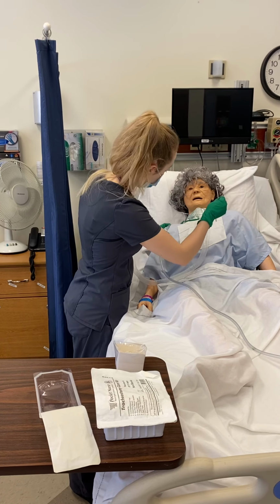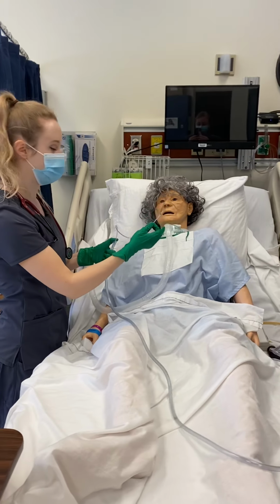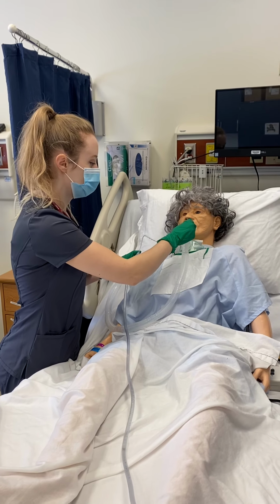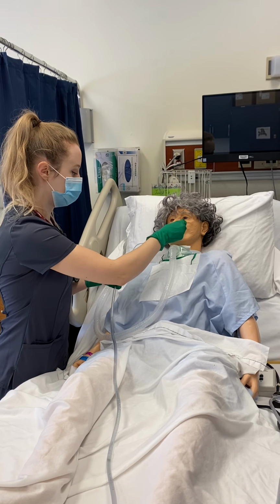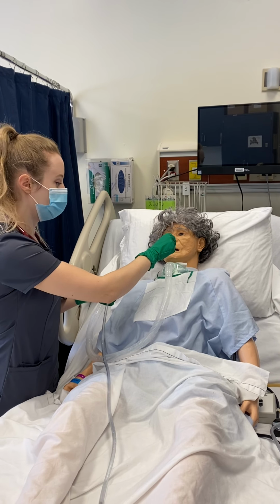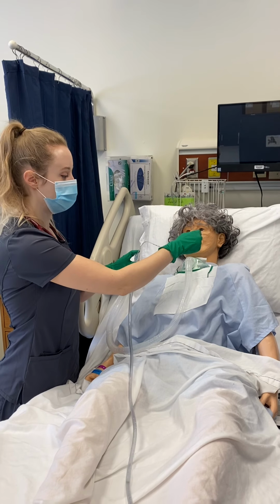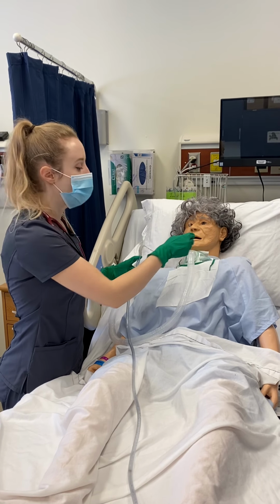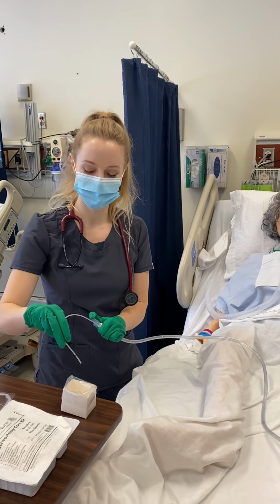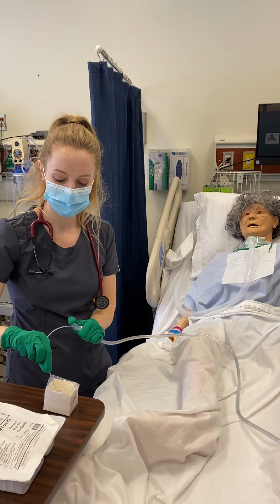Looking at my patient, I will go in, I'm choosing the right naris. I would choose this for how patent the naris is and how much room I feel like I have. I will insert until I have gone the distance that I measured, and I will withdraw slowly, providing intermittent suction for about 10 to 15 seconds. I'll give my patient about a 30-second rest in between suctioning attempts, and I will rinse the secretions out.